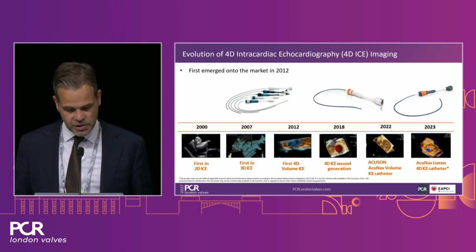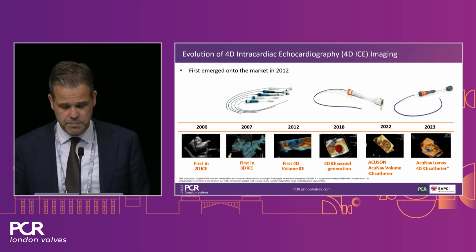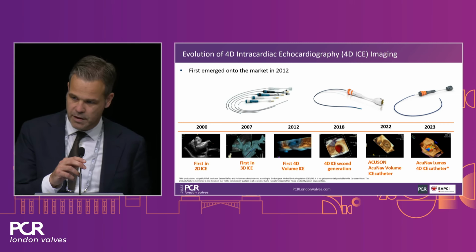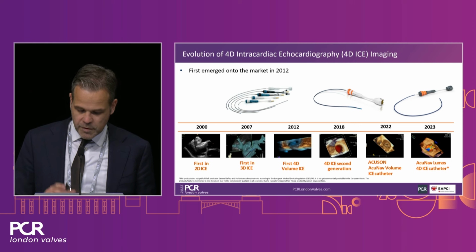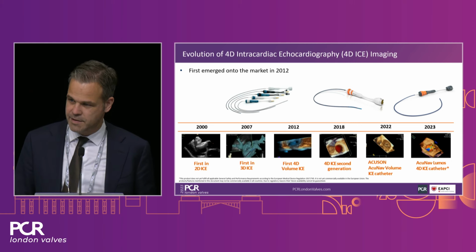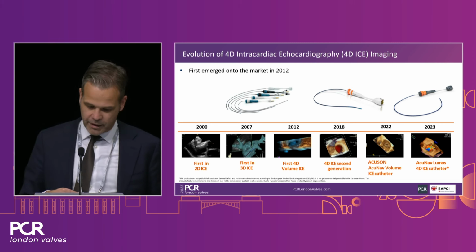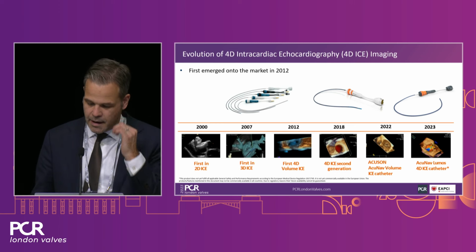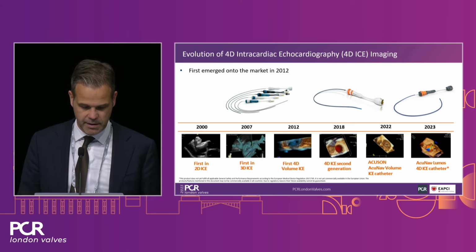So challenges enough. And if you look at different solutions, because some of these patients simply do not have TE quality sufficient enough to do this, we look at the ICE field, and I think initially it's been started already in 2000, and it evolved from first generation 4D volume ICE in 2012, where we had this very small sector, more like a thick 2D slice, but now it evolved to completely 4D ICE, where we have a high volume rate, a big sector where we can nicely visualize the tricuspid valve.